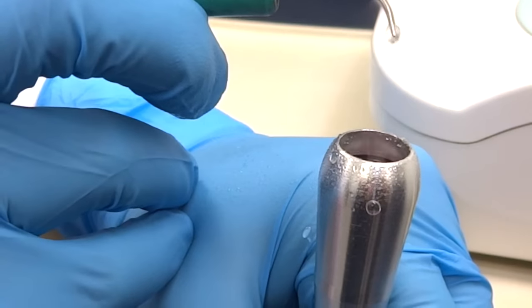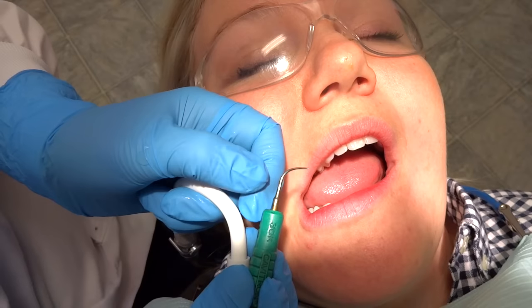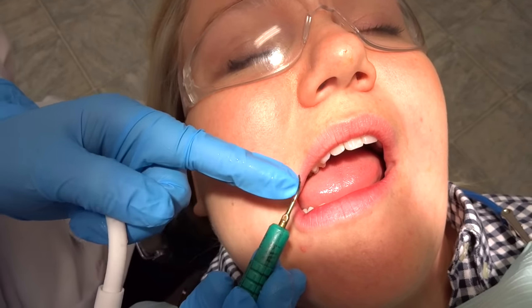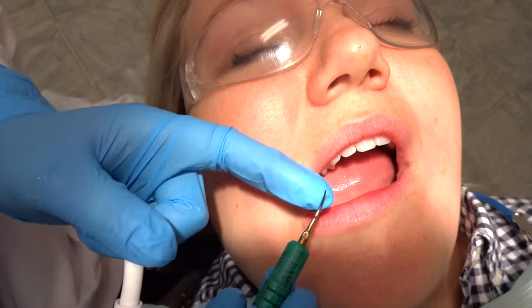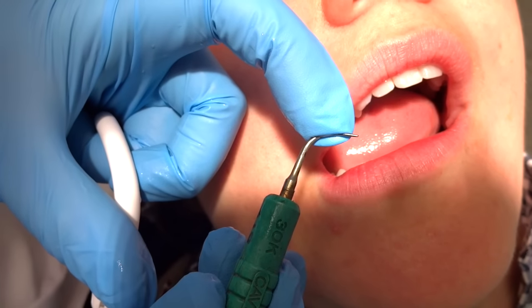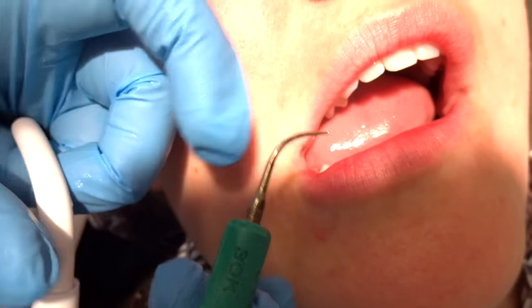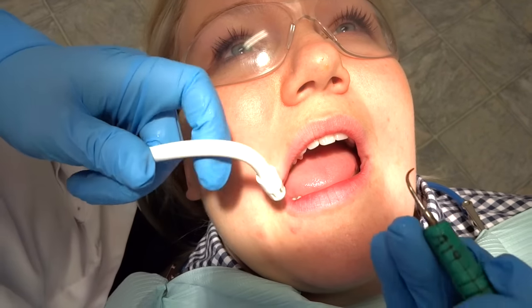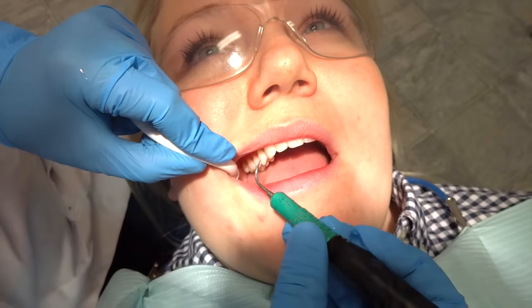For basic ultrasonic instrumentation, remember that the lateral sides of the ultrasonic are the most effective — so here and here. Also remember that the most effective part of the instrument are the last 3mm of the instrument itself. I'm going to show you both curette and probe style, how to move from one tooth to another and be effective using the ultrasonic.